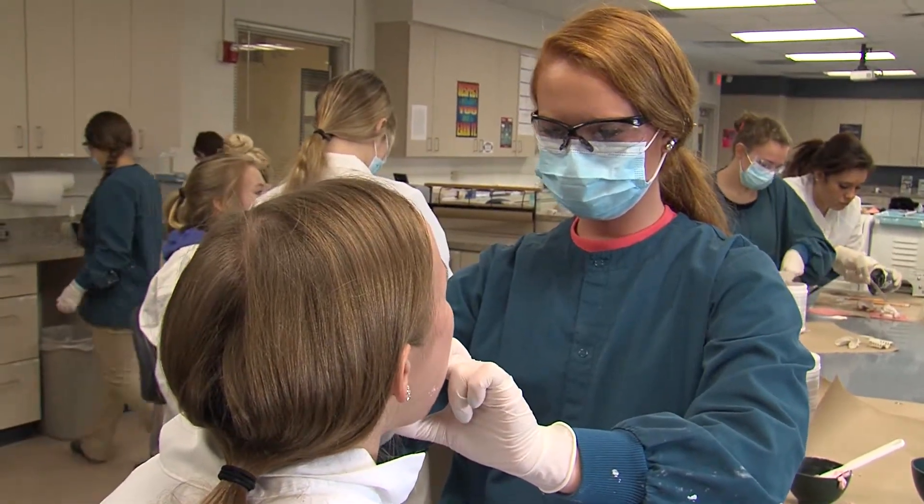Hi, my name is Monica Jenkins and I'm a senior here in the Dental Aid Program and I'm here with my instructor Mrs. Pilgrim. We learned how to take impressions on each other because that's something we're going to be doing every day in class almost.